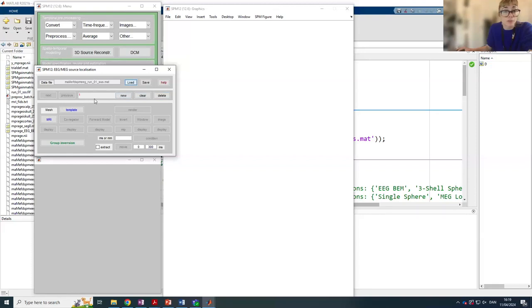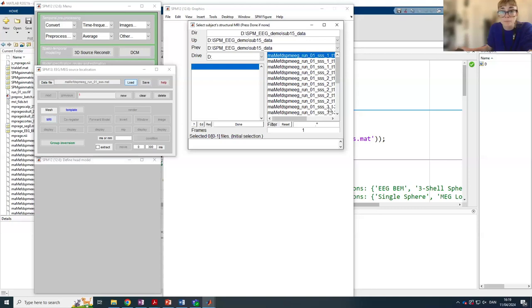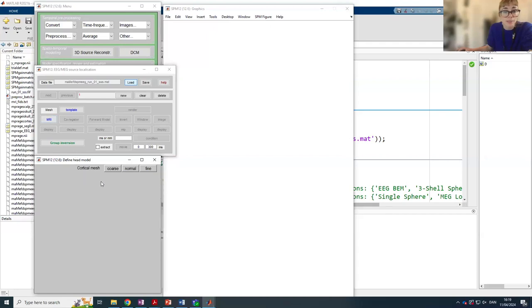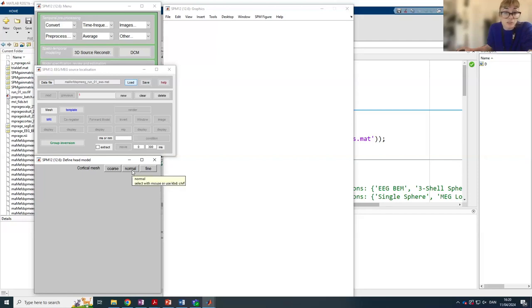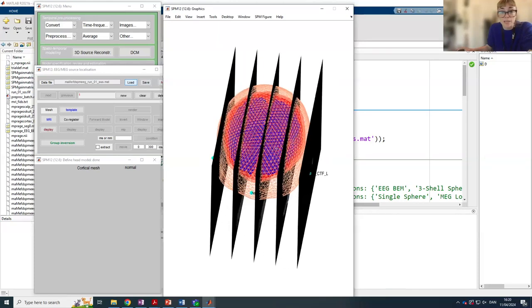With SPM you can perform multiple source reconstruction analyses using the same dataset. This analysis has index 1, and when we look at the batch we will perform a second source reconstruction. The first enabled buttons help us construct our cortical mesh, using either a single subject MRI or a template MRI. We have a structural scan from participant 15, so we load that. The mesh resolution options are coarse, normal, and fine — referring to the number of source points: coarse has about 5,000, normal about 8,000, and fine around 20,000 dipoles. For most applications, normal is sufficient.